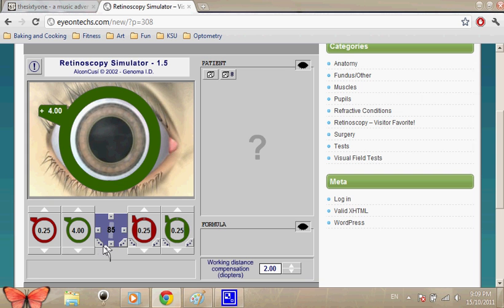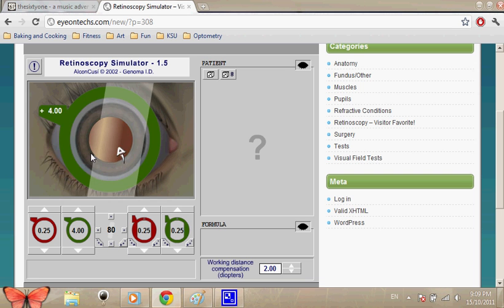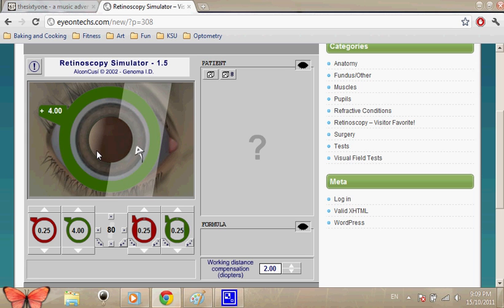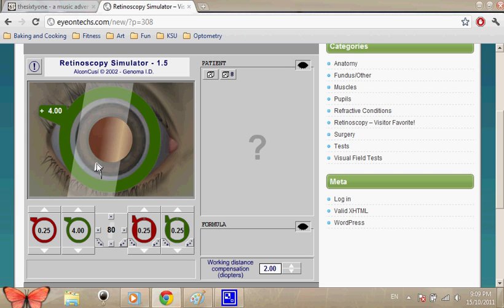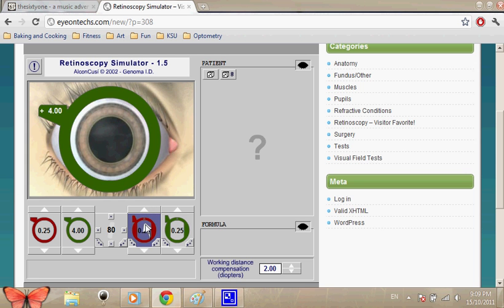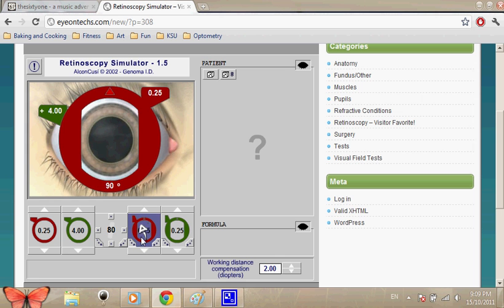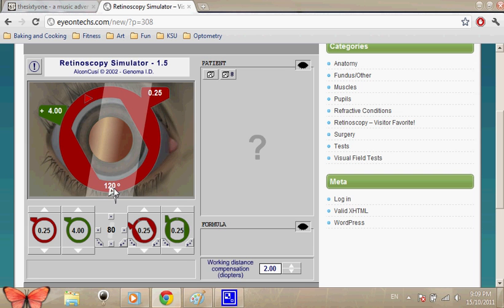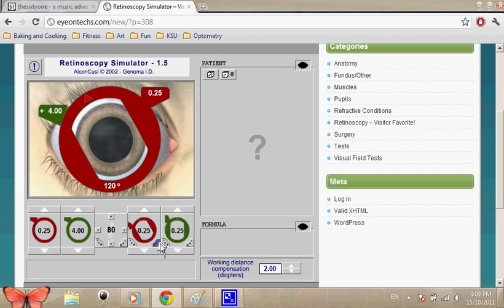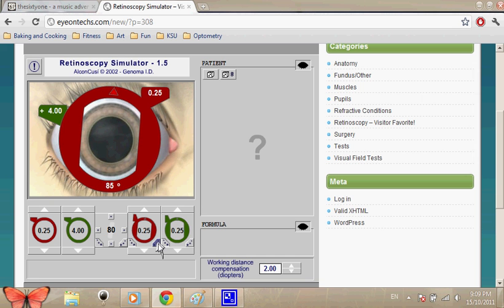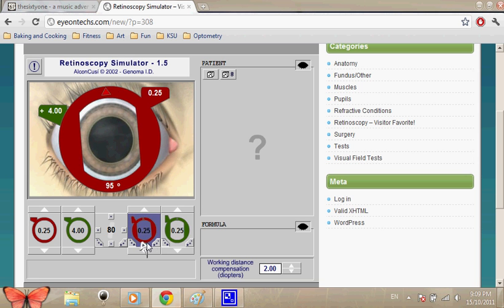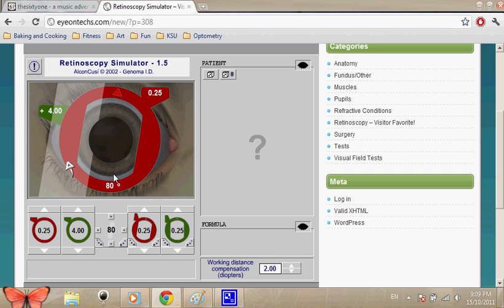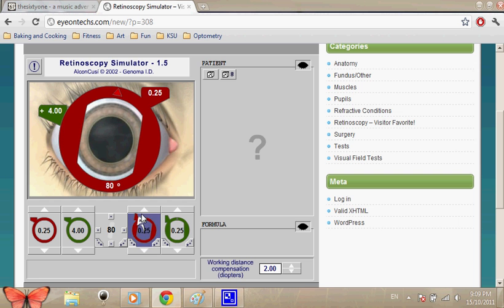And here you can see a negative motion. We can do it with sphere, but for now I prefer to do it sphere cylinder, because it's easier. I'm going to align. You can see right there, there's the axis of our cylinder lens. So let's just go ahead and align with the axis of the beam, which is 80. There we go. So, still against. We're going to add a bit more minus power, still against. And neutralization.